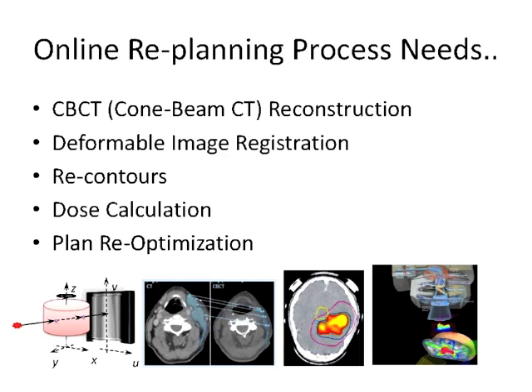You do a quick ad hoc cone beam CT, and use it to calculate where the tumor is now, because the original plan was at least a few days ago, so the tumor position might be different now. Also, where the patient is lying down might not be exactly the same as before. So we have to know how the tumor is reconfigured, and we have to match it with the previous analysis. So this reconstruction is required inside the loop.